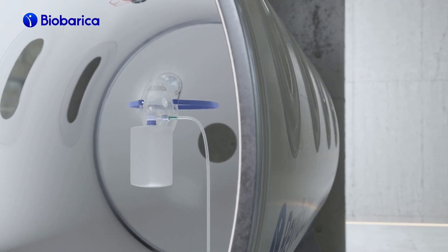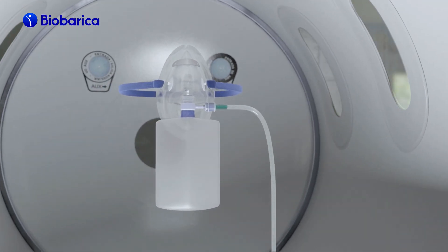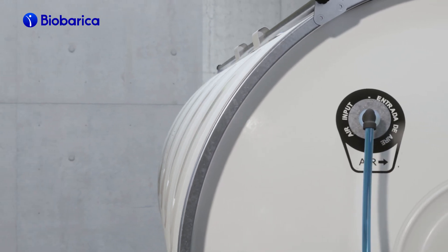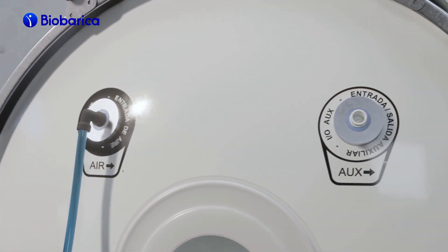Inside the chamber, high concentrations of oxygen are breathed through a mask with a disposable reservoir for each patient. This device has an auxiliary input compatible with any oxygen source, either concentrator, tank, or central line.